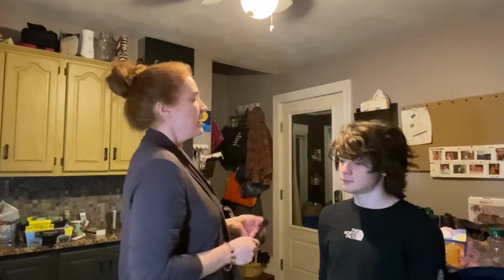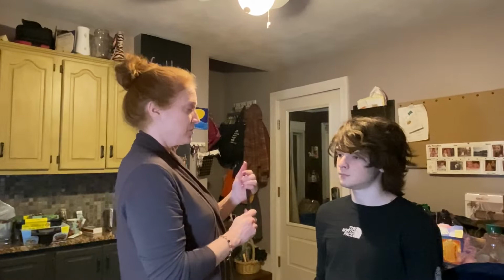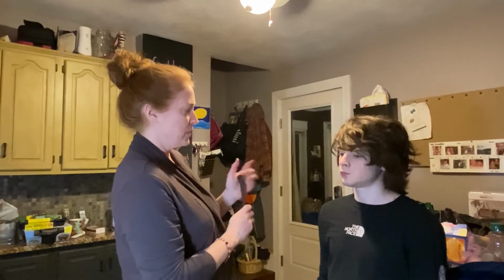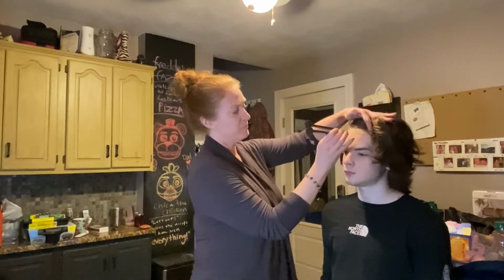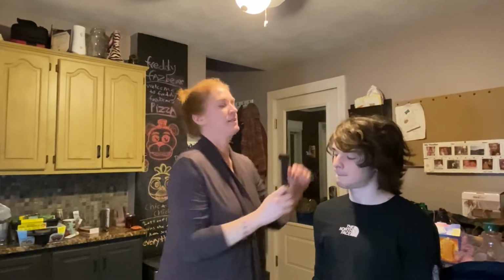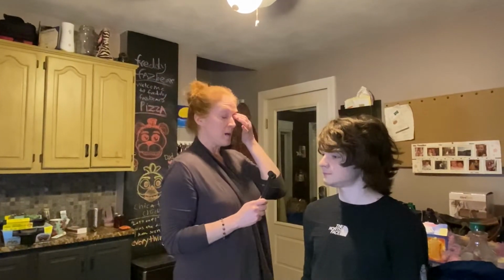Now I'm going to take my tuning fork and we're going to assess for hearing with the Weber and Rinne test. First is the Weber test. I'm going to set off the tuning fork, put it on your forehead, and I just want you to tell me which ears you hear the noise in. Both. Excellent. All right. Now we're going to do the Rinne test, looking for bone conduction and air conduction of hearing, okay? So again, I want you to tell me when you hear the noise stop.